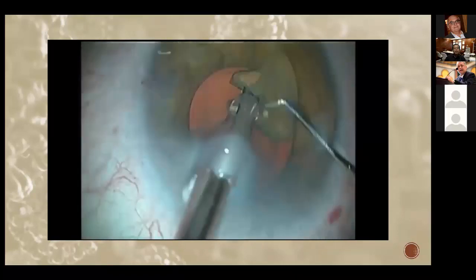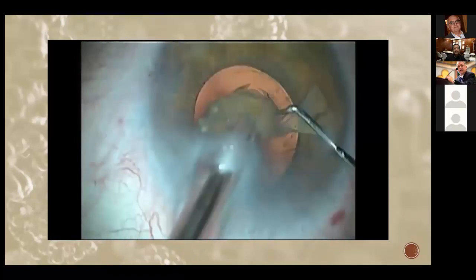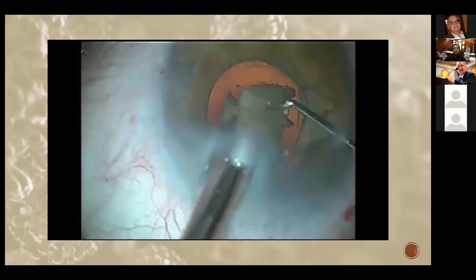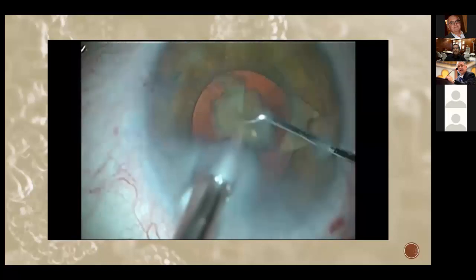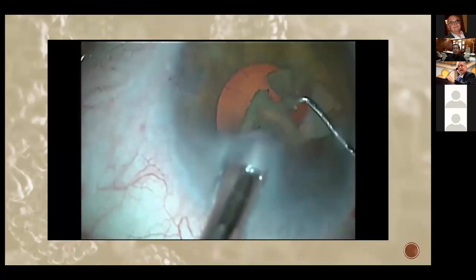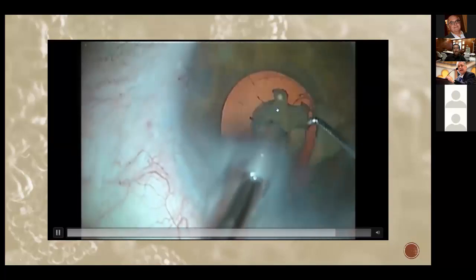And now I do my last chop, and I want you to see the spider legs that we see here. This is going to be very obvious. I'm very careful. You see the spider legs again, spider legs and release. Did you see it? It's very obvious. It will happen again.